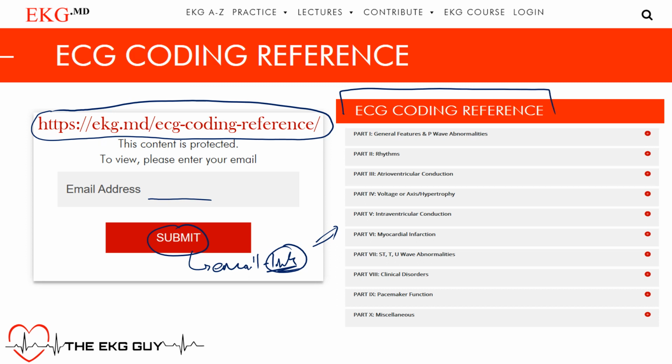So where we are is we are in part 4. We are looking at right ventricular hypertrophy today. Okay, this is a good one to know and can often be confused with a posterior infarct. So we want to be able to differentiate those two.